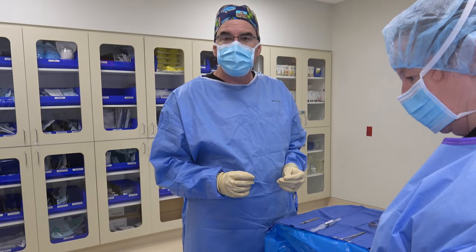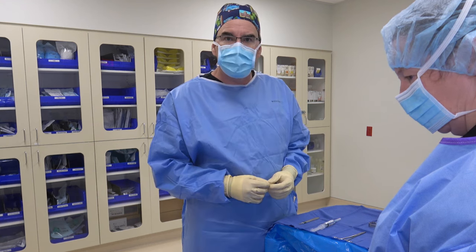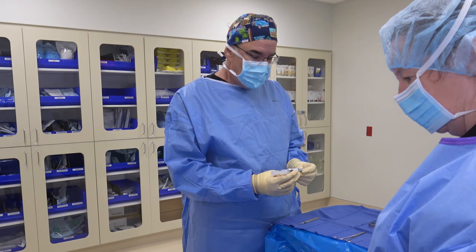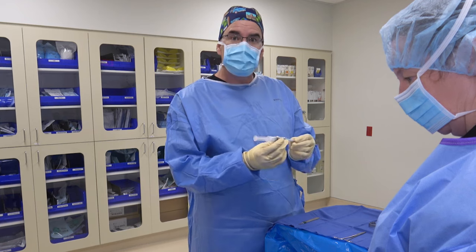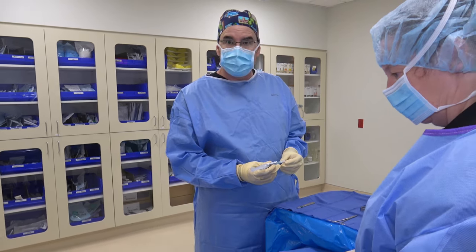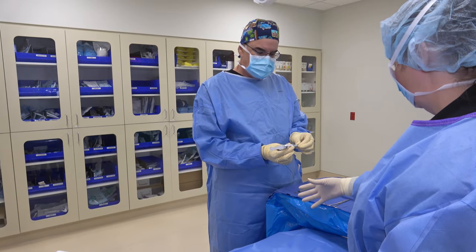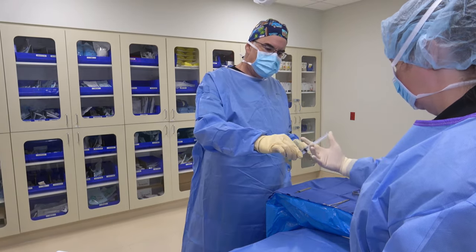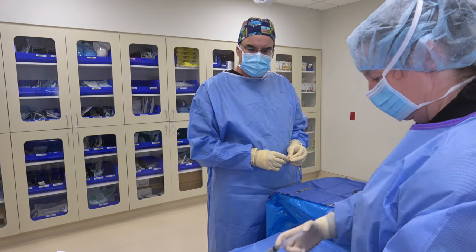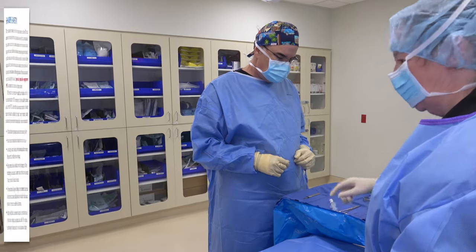There's one more key step to transferring medications: you need to make sure that your doctor knows exactly what she's injecting. So whenever you hand medication to her, you're going to state the name of the medication, the strength, and whether or not it has epinephrine. 'Local, 1% lidocaine with epi.' When the doc is done, she will place the needle on your mayo stand, needle down.